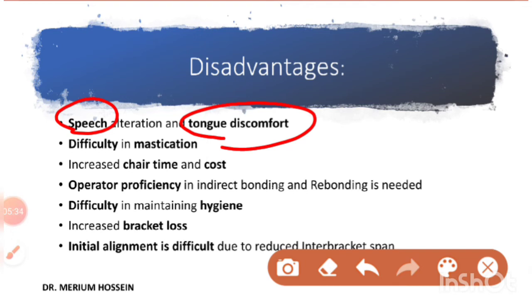For example, everything is bonded onto the lingual surfaces, and it is coming into contact with the tongue, so it is obviously going to cause tongue discomfort.